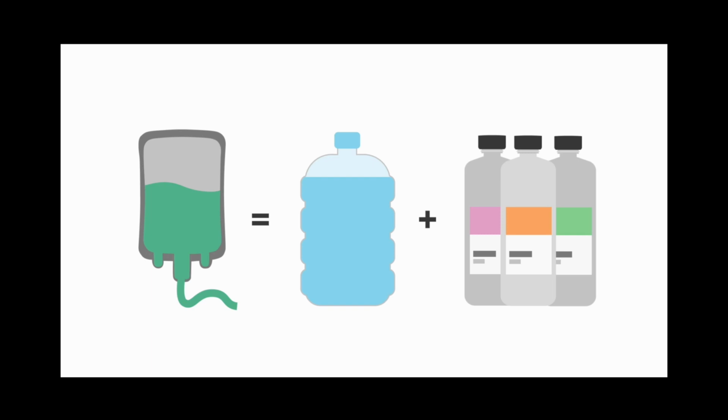So today I am going to speak about water treatment, the next class in the series on hemodialysis. My previous class was about the dialysate fluid. So now I am going to talk about the water treatment. What we learned in the dialysate class was that salts are mixed with the RO water to get the dialysate solution. So this RO water we need, that is, reverse osmosis water.